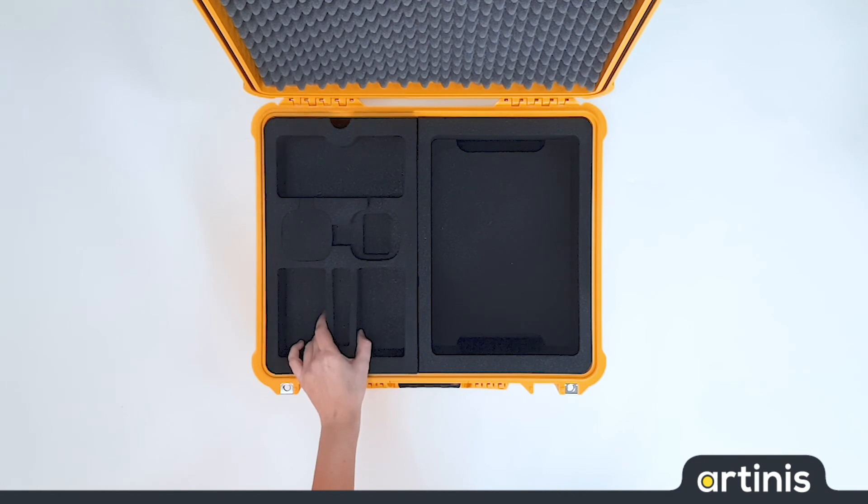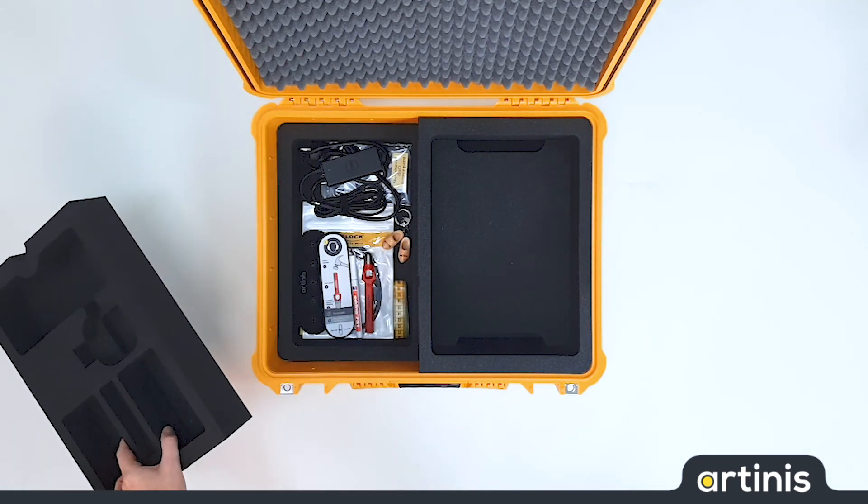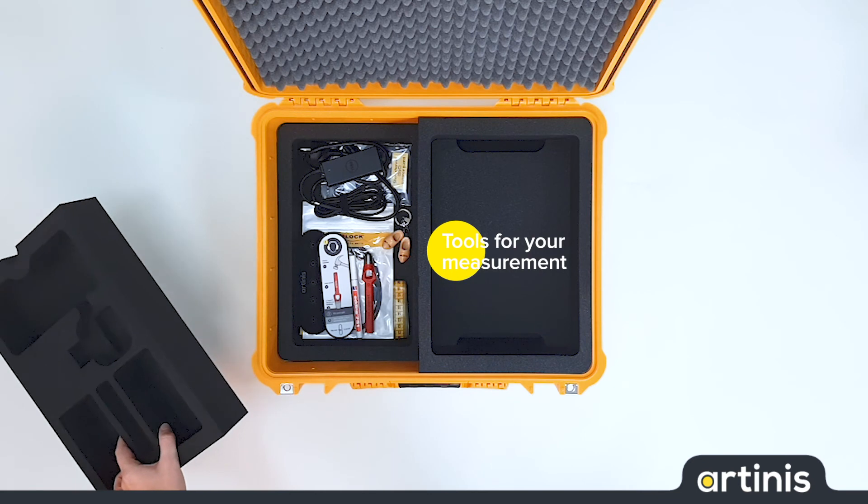If we remove the top layer here, there is some extra space for items that you might need during your research.